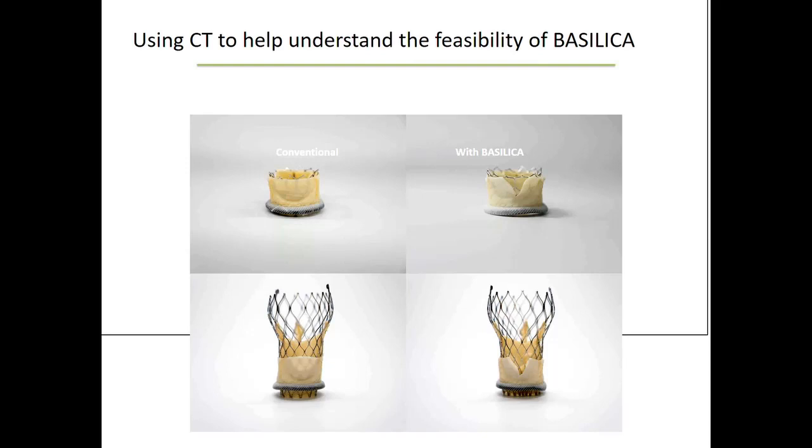So there's a procedure called Basilica, very similar to Lampoon, being led by the NIH and the Washington Hospital Center and many others. And this idea is that for patients who may have mechanical obstruction, perhaps the interventionist can alleviate that obstruction by putting in a catheter and a cautery device and lacerating, and thereby slicing either the native aortic valve or the surgical valve.